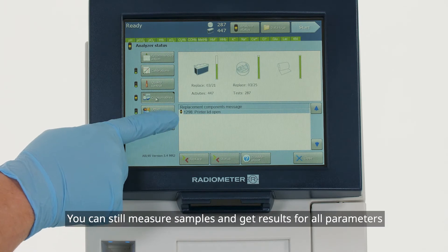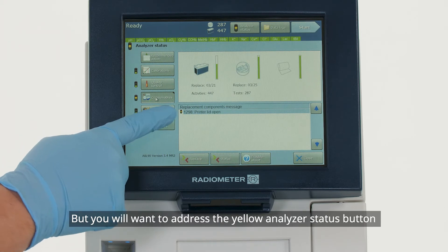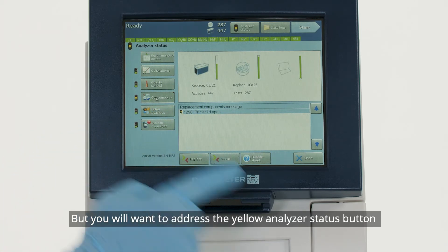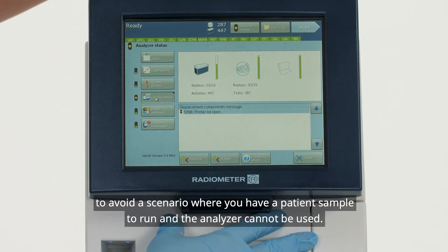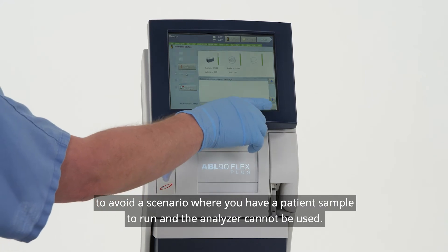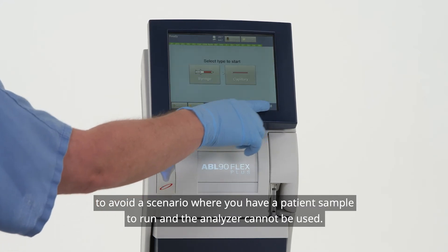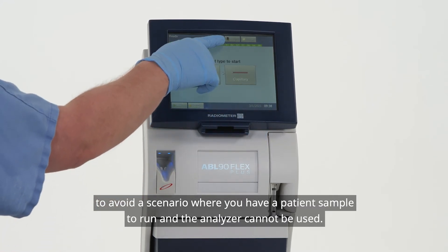You can still measure samples and get results for all parameters, but you will want to address the yellow analyzer status button to avoid a scenario where you have a patient sample to run and the analyzer cannot be used.